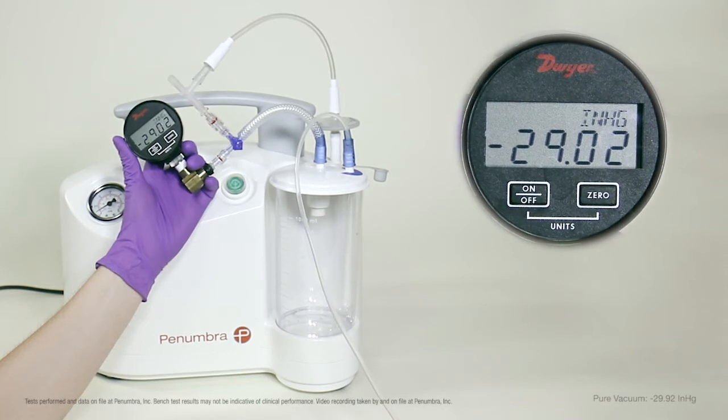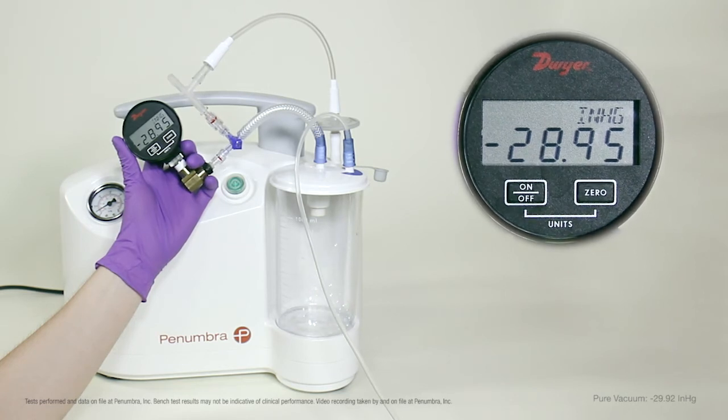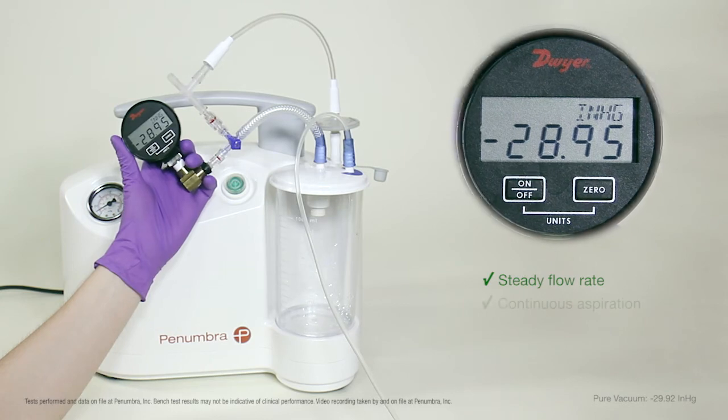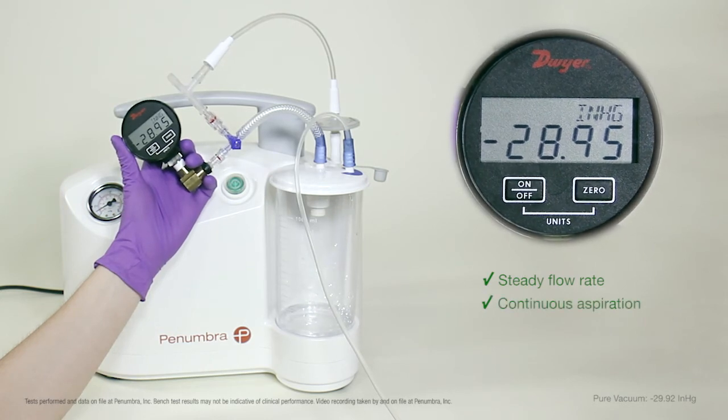When we slide the flow switch to the ON position, water begins to flow into the canister. We see steady vacuum, which causes a steady flow rate, and subsequently, continuous power aspiration.